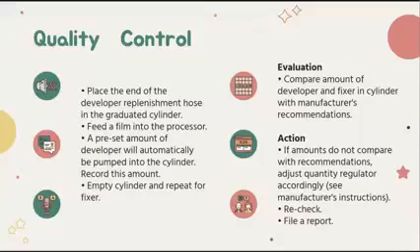And evaluation, compare amount of developer and fixer in cylinder with manufacturer's recommendation. So the replenishment rate recommended by the manufacturer should be the same as the test, okay, that you have done.